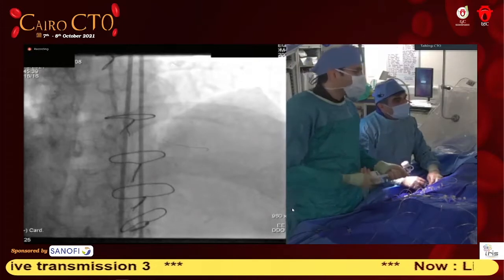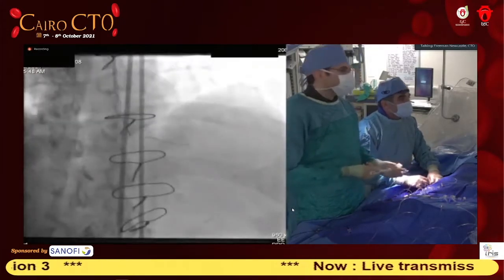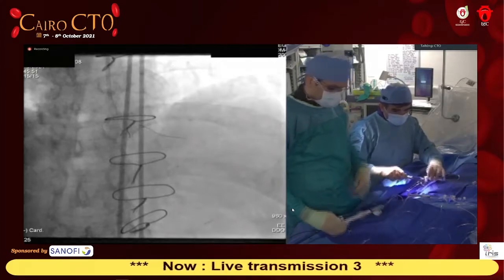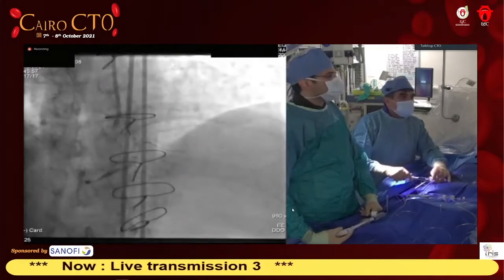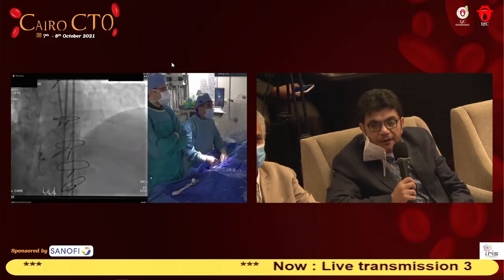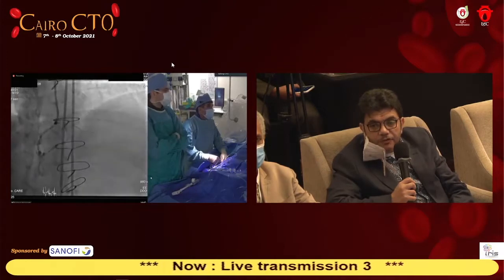I thought, Dr. Adil, that if we leave the vein graft, mostly we encourage stent thrombosis. The RCA is mostly diseased all through, so your procedure will be covering from most distal to most proximal. When you leave the vein graft functioning, there is probably demand and competitive flow all through, and this could also be a factor that encourages stent thrombosis.